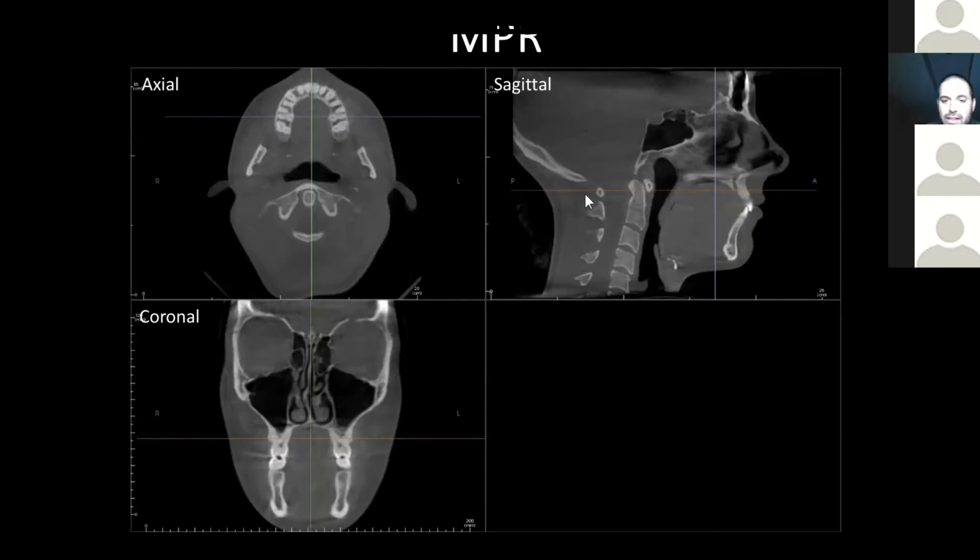All right, so this line right here tells us the exact location that this slice shows up. Similarly, if I want to know where this coronal slice is coming from, I can look in the other views and find this purple line here that's in a coronal orientation. And this line right here is going to tell me exactly where this coronal slice is coming from. Okay. You can use these dynamically in the software. In my slide here, everything's fixed, but what I can do in the software is pick these up and move them around and scroll it up and down and side to side.